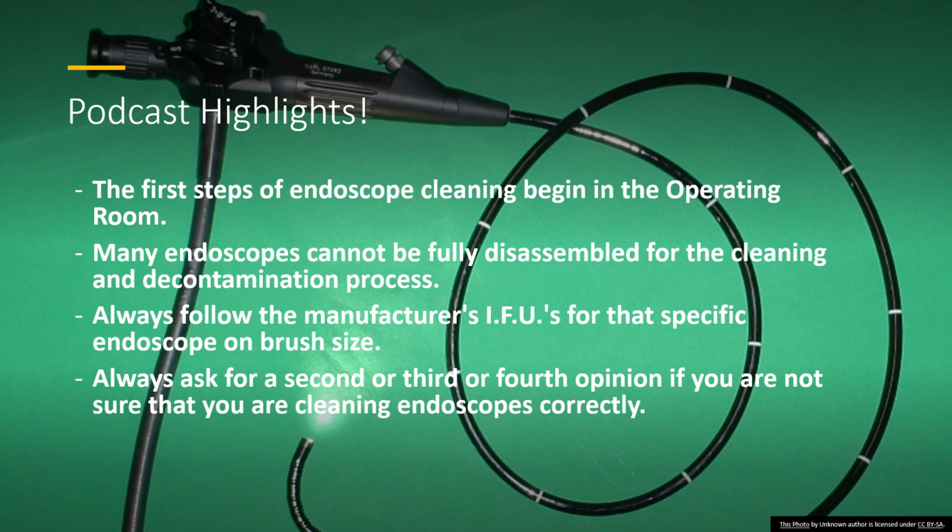Always follow the manufacturer's IFUs for that specific endoscope, and always ask for a second or third or fourth opinion if you're not sure that you are cleaning endoscopes correctly. Somebody with more experience than you will definitely help you out.